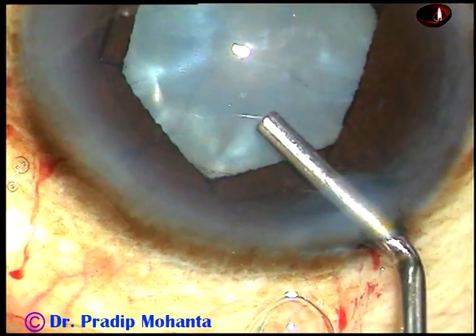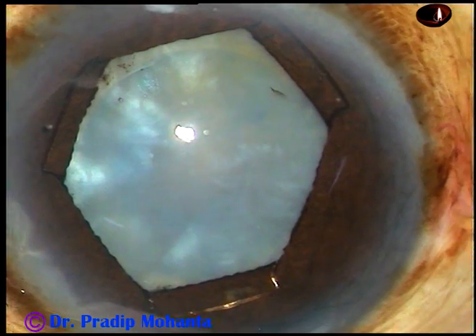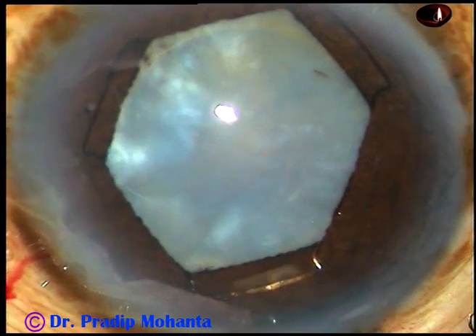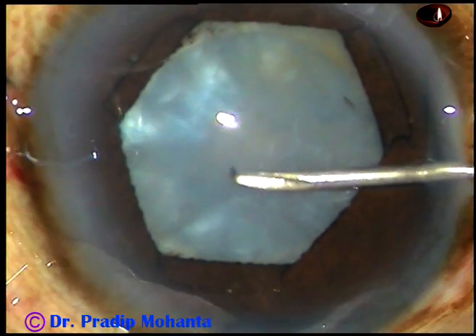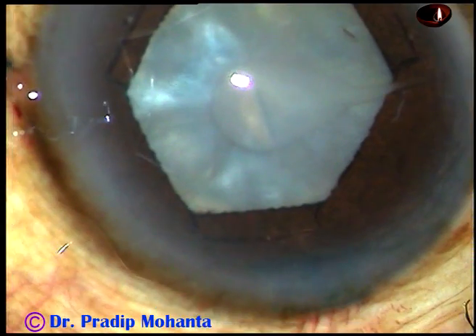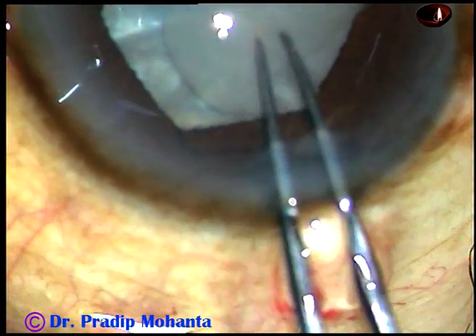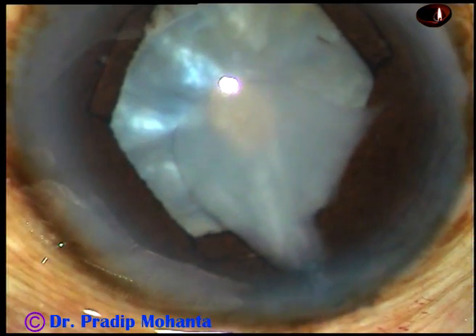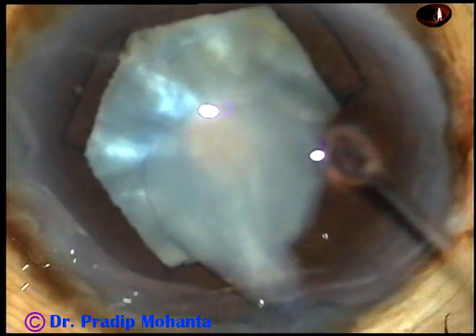And now the capsulorrhexis is to be done. Some viscoelastic substance is injected into the anterior chamber. Now I take a 26-gauge bent needle cystitome, go through the right side port, and make a cut at the center of the capsule, making a curved flap. Now I hold this flap with utrata forceps and make a very small opening — this is a mini-rhexis. I convert that flap into this mini-rhexis.